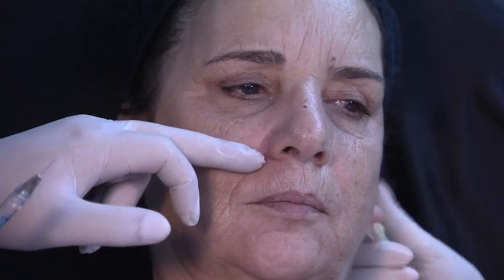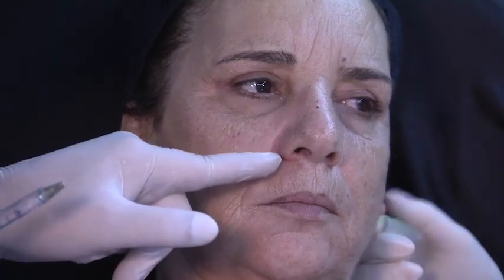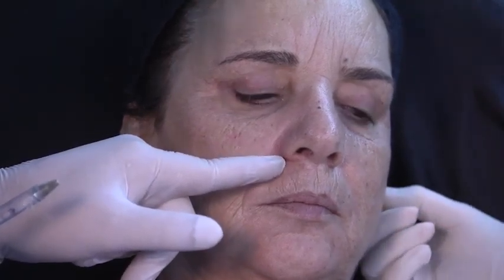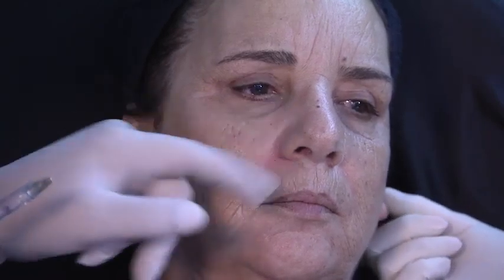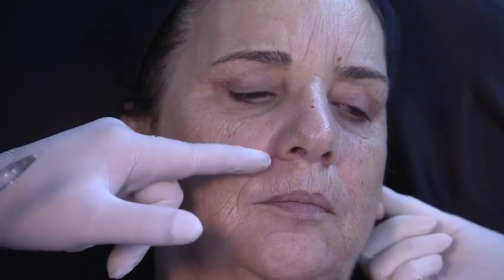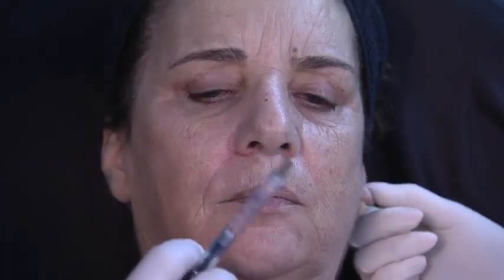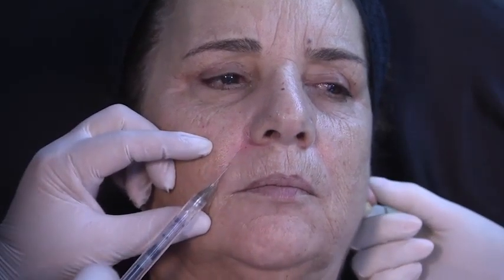I don't want a lot of product superficial in that piriform triangle because if not, when she smiles, it will be visible. Right, so you're just offering support in this area. Exactly. I'm restoring the loss of bone structure in this area. When we age, that bone, that fossa becomes bigger, opens the piriform fossa. So I'm replacing a little bit of bone structure there. Because I'm in my clinic, I'm not going to open a Nasha technology for only this point. I'm doing it with Define.